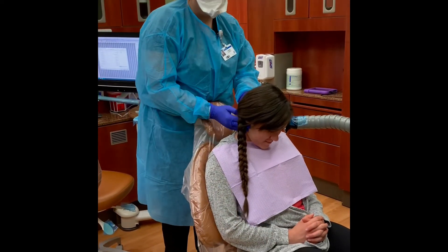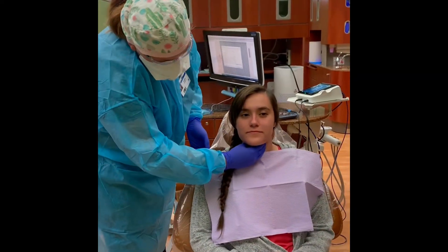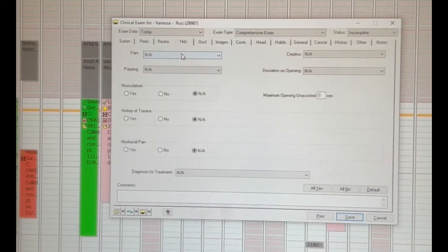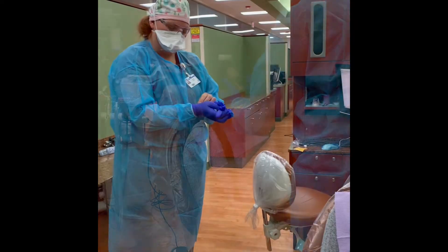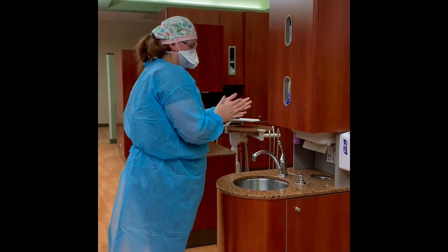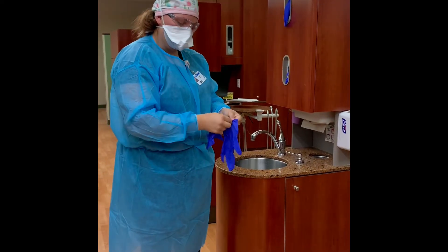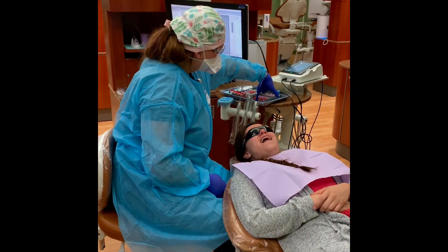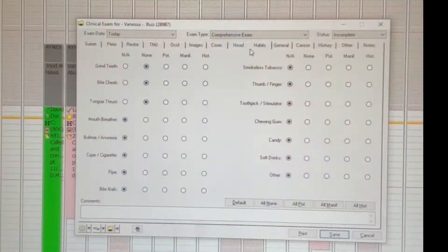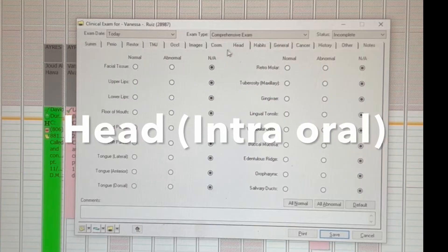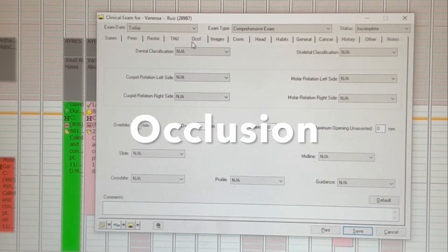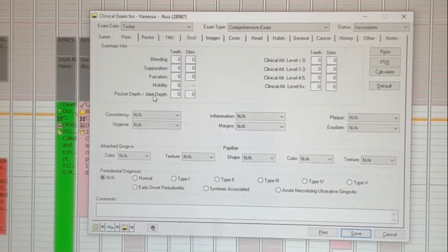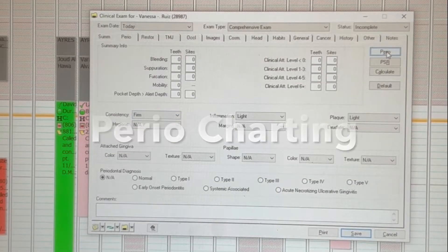Complete the extra oral examination and the TMJ check, and note these in the appropriate tabs in the clinical exam. Doff dirty gloves and cleanse your hands. Don a pair of clean gloves before starting the intraoral examination. Now complete intraoral assessments: complete intraoral examination, occlusion, periodontal descriptors, and periodontal charting.